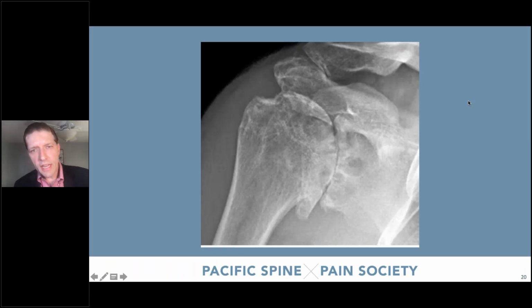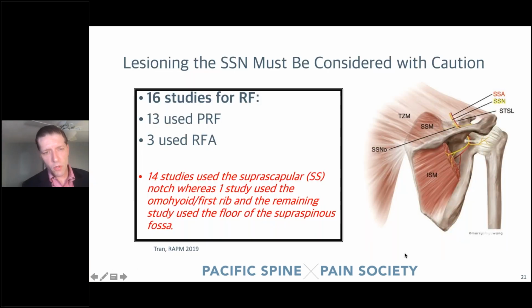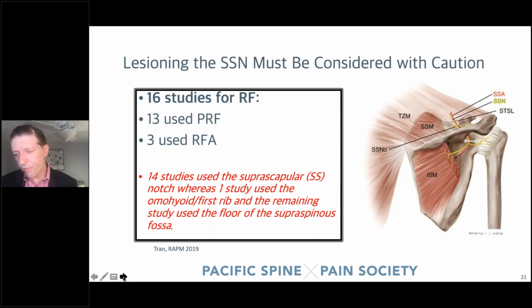Getting into the shoulder, and next slide after that, this is a patient, once again, who has bone-on-bone osteoarthritis, luxation, just go back one slide real quick, and was not a replacement candidate. Next slide. A lot of the literature recently is focused on purely looking at ablation techniques or pulse radiofrequency. And as Dr. Salmasi said, pulse radiofrequency is not an ablative technique. You're not destroying the nerve.